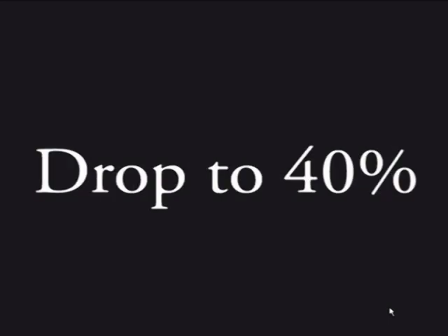And after that, I drop them right down to 40%. I don't titrate down, I don't screw around. You go right down to 40%. Instantly, 5 minutes into their ventilator course. Please, please don't leave these patients on 100 for hours before you titrate their vent. Go right down to 40. And while you're still at the bedside, see what happens. You'll see the results of that FiO2 drop within a couple minutes. You don't have to wait forever.